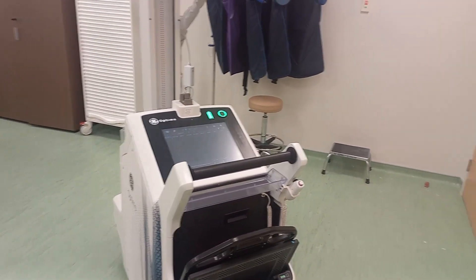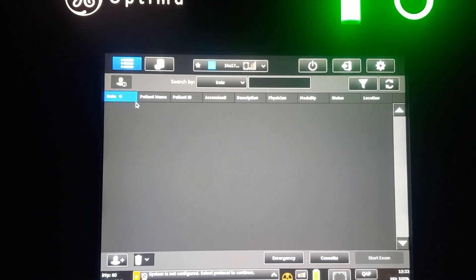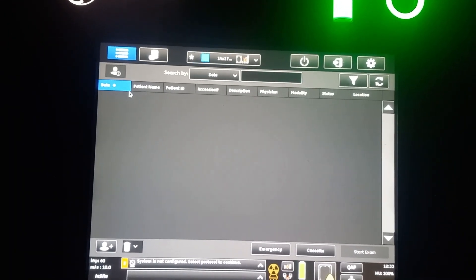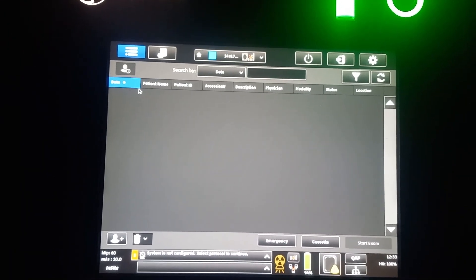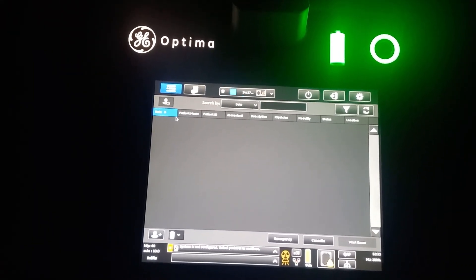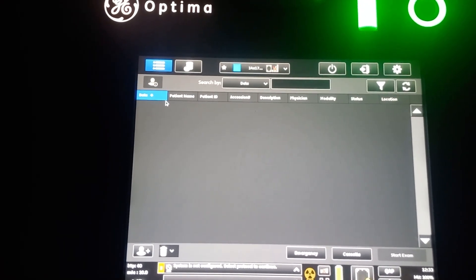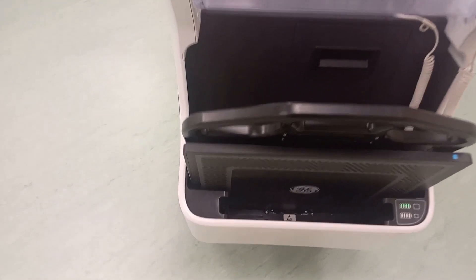Let's talk a little bit about the applications. I'm going to switch off the lights — there you go, that's what your application screen looks like. You have battery level indicators, power light, and all the basics — everything's there.